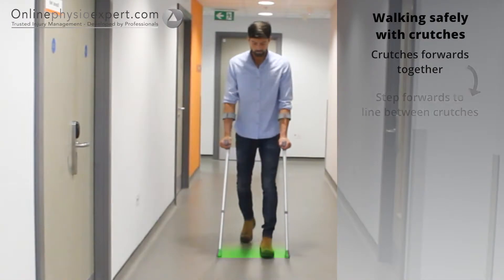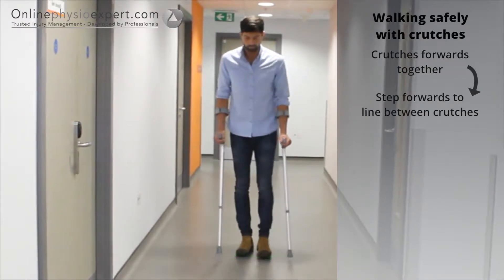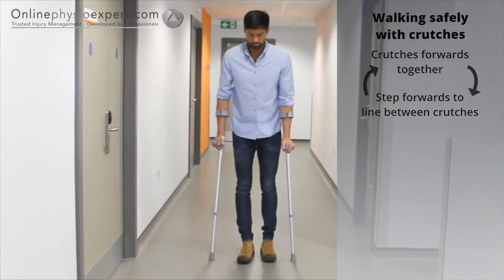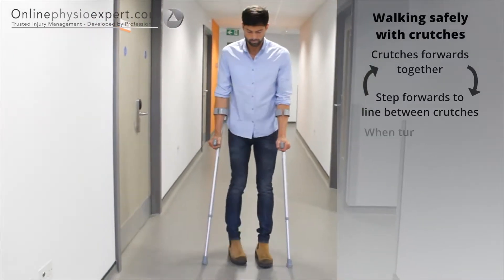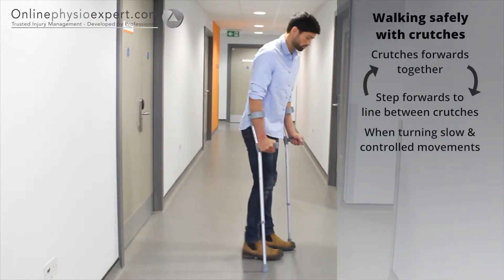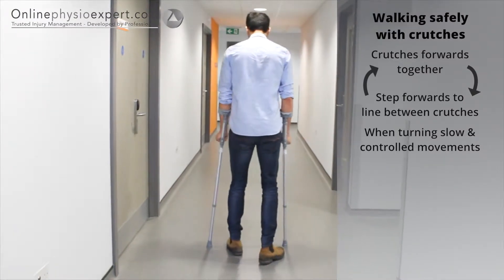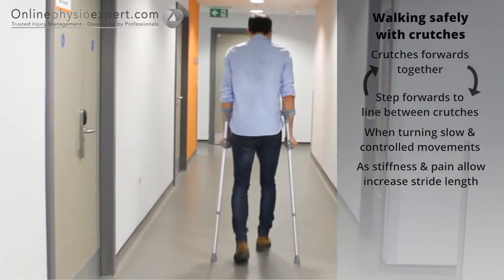To walk safely with elbow crutches, place your elbow crutches and injured leg a short distance in front, then step your non-injured leg forwards to lie between the crutches. When turning or manoeuvring in tight spaces, ensure you hop round in a controlled manner to change direction. As pain and balance allow, you may increase your stride length beyond the line of the crutches.